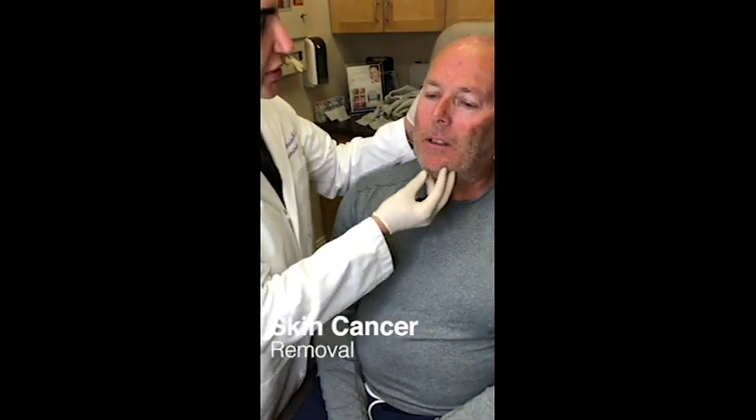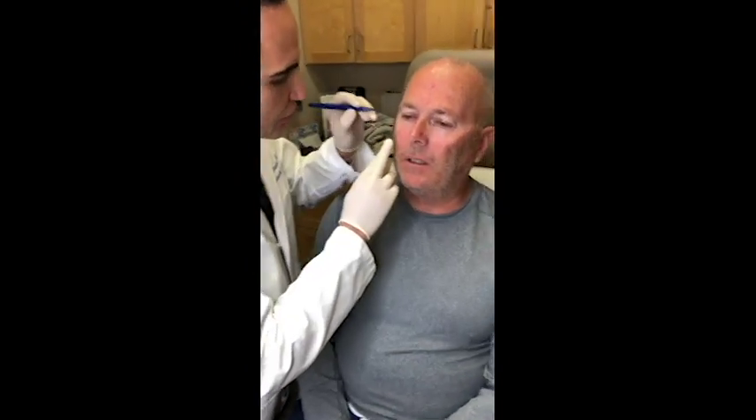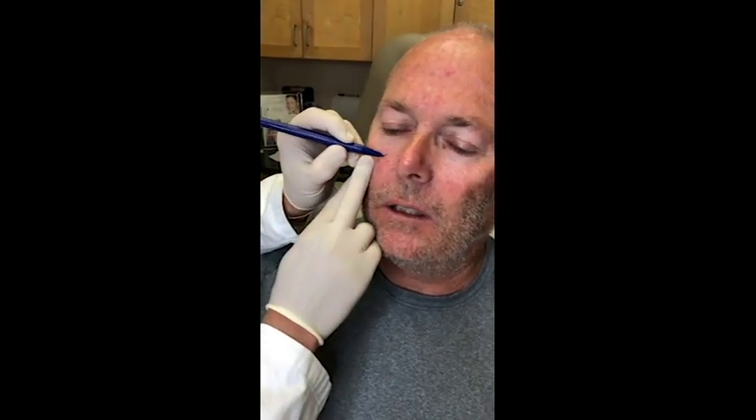I have one of my favorite patients over here. Coach is here with skin cancer on his right cheek, partially affecting all the way up into the right lower eyelid. We found this a little bit over a month ago. We're going to perform Mohs micrographic surgery, which is a special type of surgery to maximize the curability of the cancer, plus minimize the amount of good tissue to remove. What we do is we first delineate it by marking the area which we see.